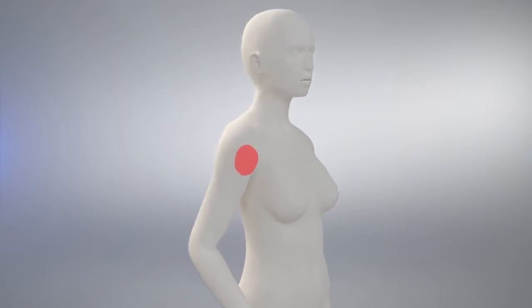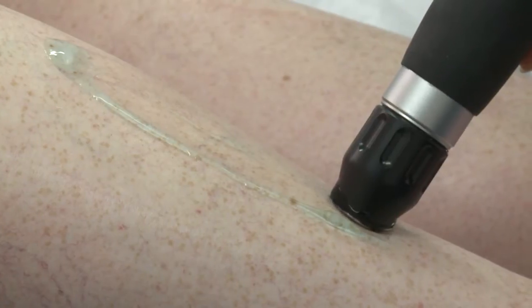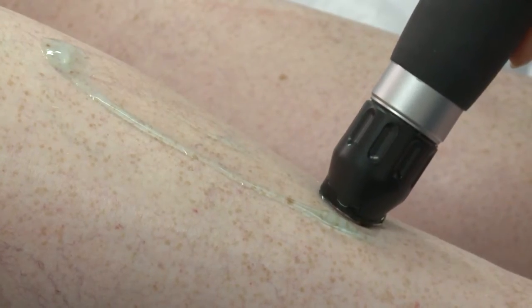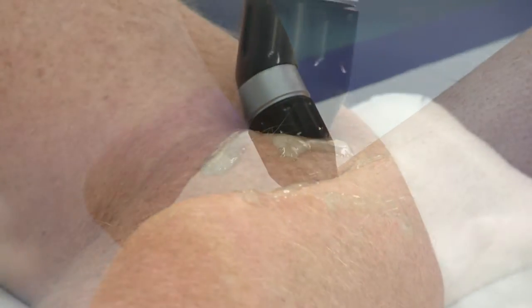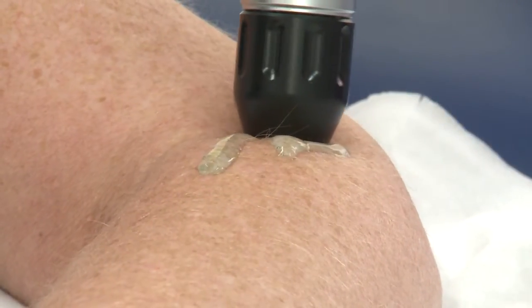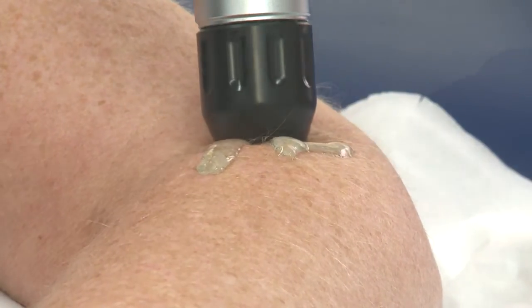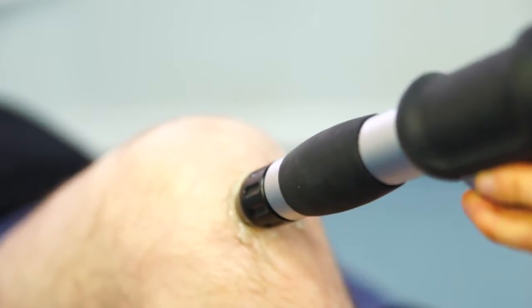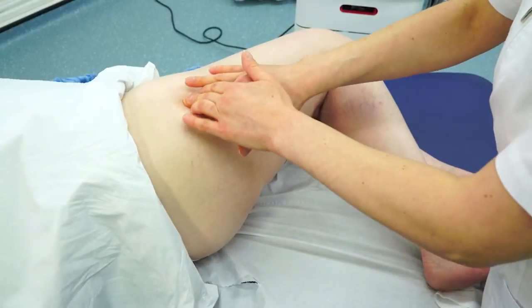During an Extracorporeal Shockwave Therapy session, high energy sound waves are created and focused on the injury site using a special pad. Shockwaves are repeatedly applied to the injured area to break down any scar tissue and or calcifications in the area, which in some cases the body is unable to repair itself. As the tissue is broken down by the shockwave, the body starts rebuilding new tissue, replicating the body's own self-healing process.